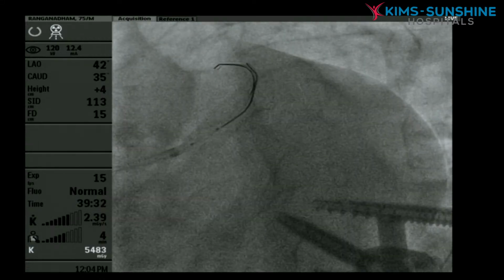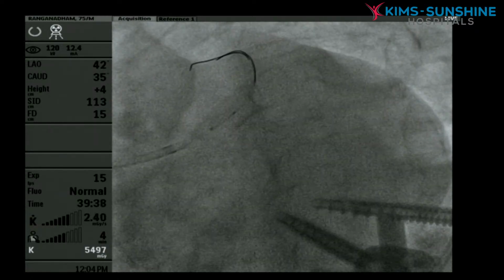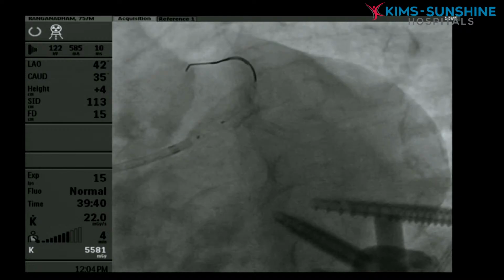వెళ్ళిపోయిందంటే డిలీట్ అన్నట్టు. స్మాల్ స్టెంట్ అవపడతామండి. సీ, స్టెంట్ యూ ఆర్ ఏబుల్ టు సీ కదా. ఐ విల్ కమ్ స్ట్రైట్. నో, స్టెంట్ అవపడుతుంది కదా. Do it.